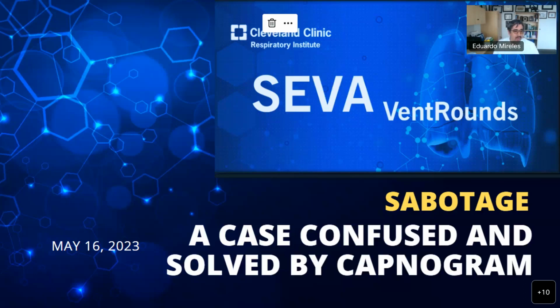Today is May 16, 2023, and today's case is one of pure and clear sabotage. This is a case that was confused and solved by a capnogram. We're going to share this case with you in the next 30 minutes.